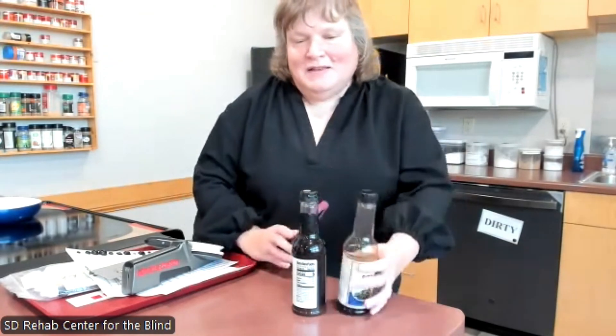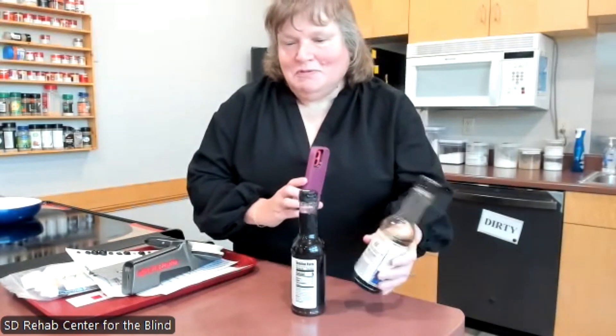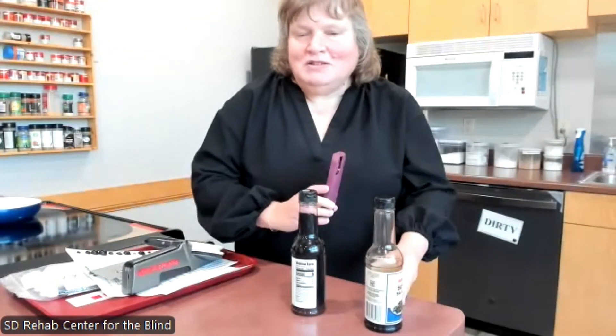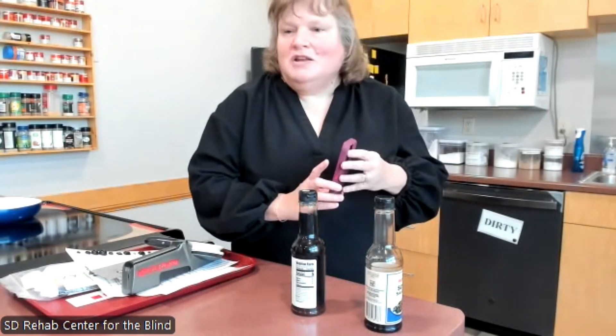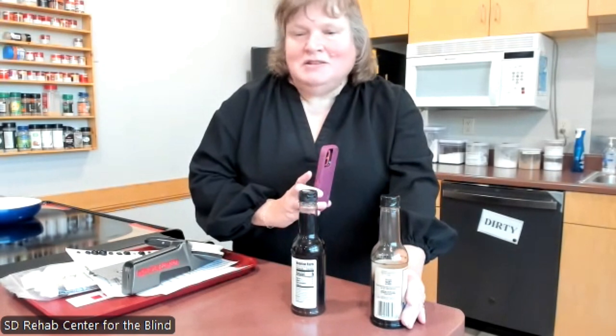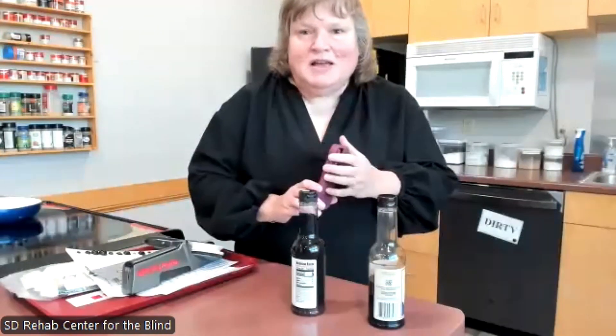The Seeing AI app identified the soy sauce, and you can press 'get more info' to read what the whole label says. This is amazing to me, coming from somebody who lived during the time where labels were very inaccessible. To put this in my hand and be able to find the soy sauce that quickly is remarkable. Seeing AI can also read instructions on cake mixes, Hamburger Helper, and cleaning products — things I never even knew were on cleaning product instructions. That is the last piece of equipment I want to show today.